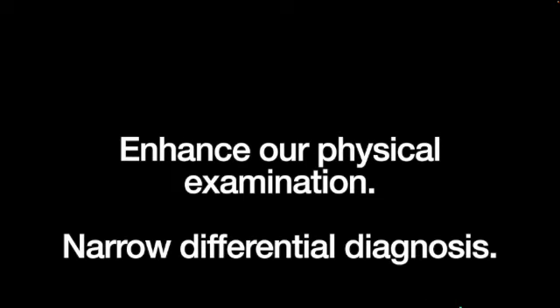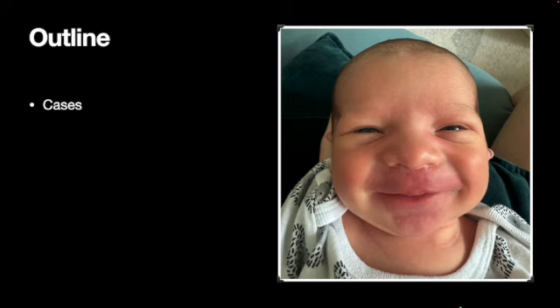We love point-of-care ultrasound because, quite frankly, some of our physical examination components just aren't very sensitive, and POCUS, or point-of-care ultrasound, really helps to enhance that. And like I said before, it helps you narrow down the differential, what's happening with the patient at that moment. Our goal today is to go over a few real-life cases, how you can integrate what we're going to teach you on our hands-on in November, and take that and integrate it into patient care at the bedside.